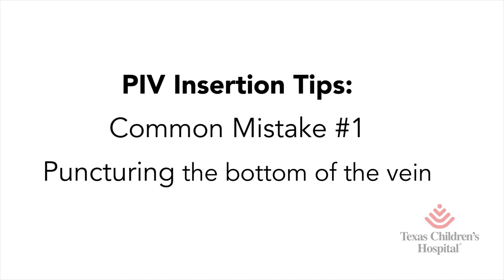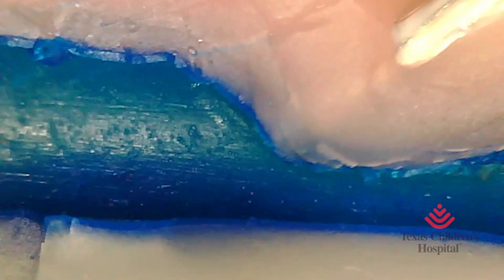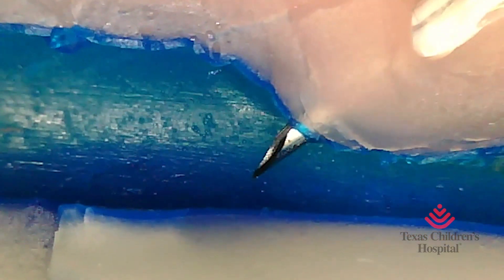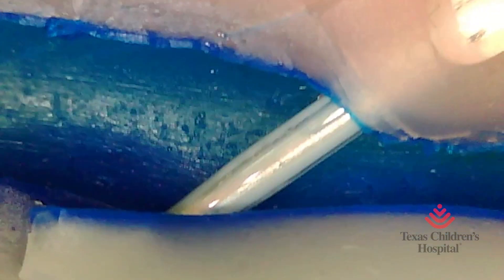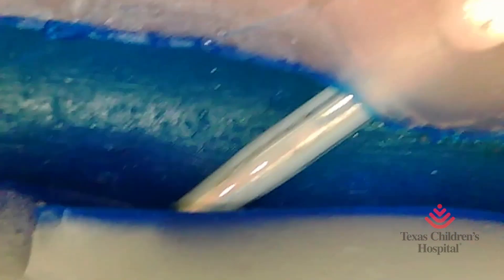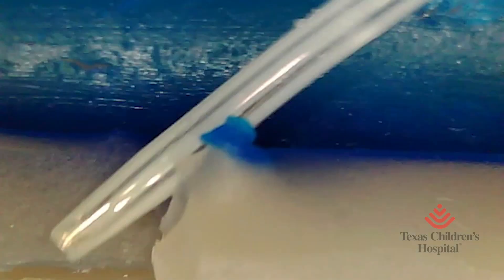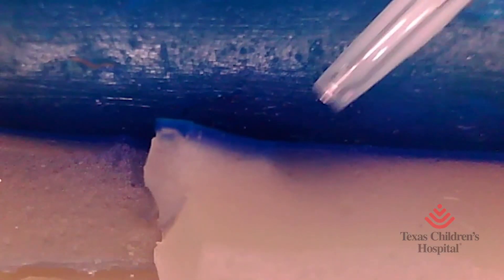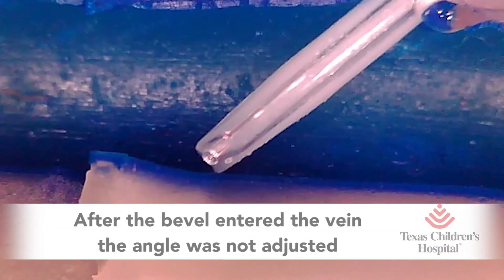If we don't stop immediately upon seeing flash, our needle can advance through the top wall of the vein and through the bottom wall. When the catheter is advanced in this situation, it will kink and we'll get a blown vein.